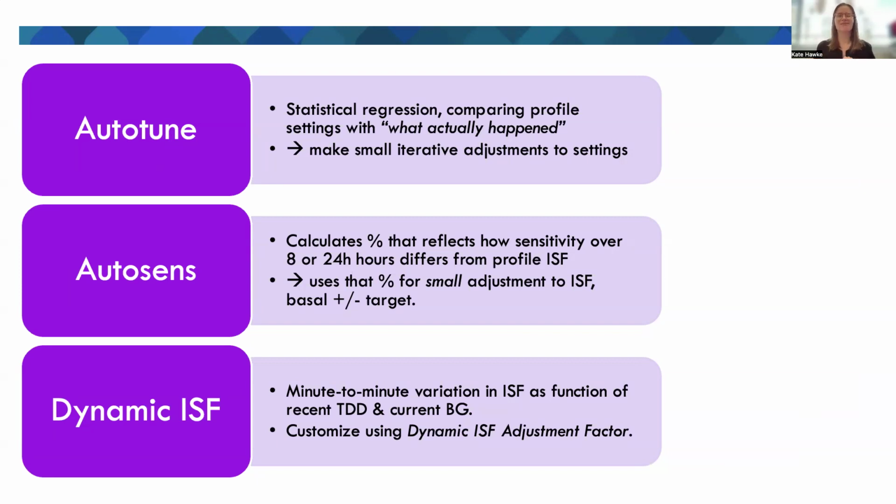So for a clinician, think of this a little bit like if you sit down with somebody who's on a commercial AID system and you take a look at what their normal scheduled basal is, and then you take a look at what the basal is that they're receiving on their automation. Sometimes you look at those two together and think, do I actually need to tweak their regular scheduled basal a little bit so that it's actually reflecting their true requirements as demonstrated to me by automation? Think of AutoTune a little bit like that.